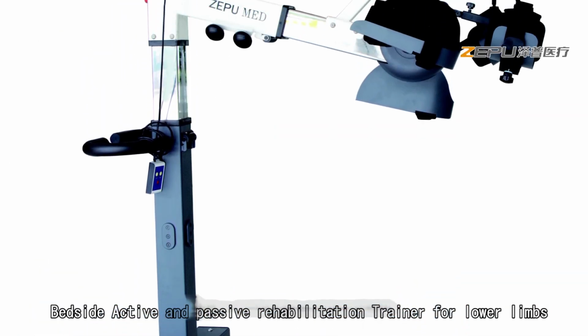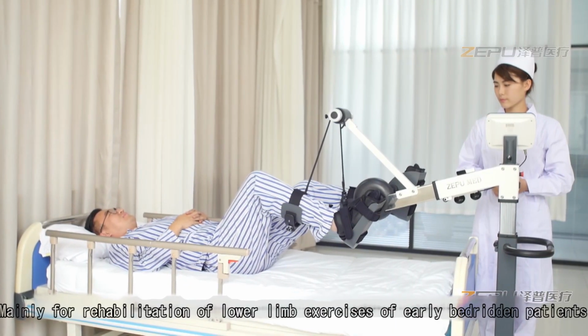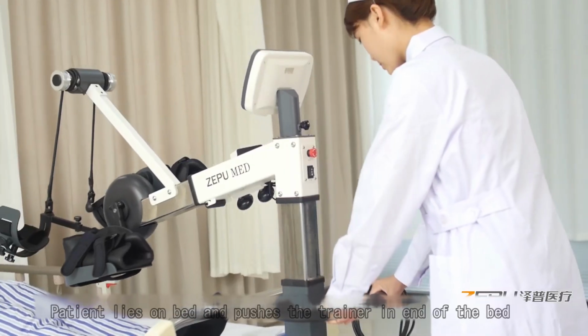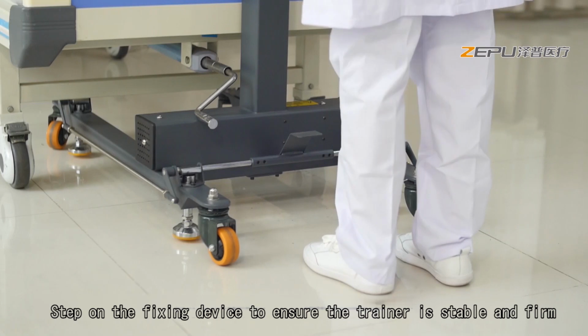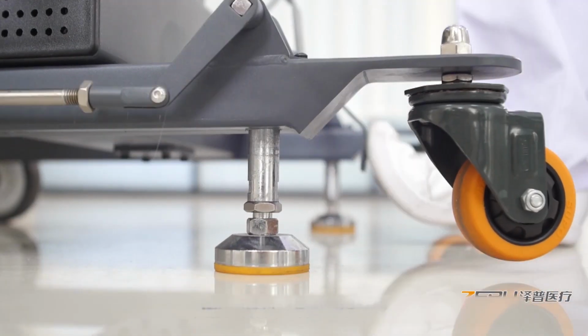Bedside active and passive intelligent rehabilitation trainer for lower limbs, mainly used for early rehabilitation exercises of the lower limbs in bedridden patients. The patient lies on the bed, and the trainer is pushed to the end of the bed. Step on the fixing device to ensure the trainer is stable and firm.